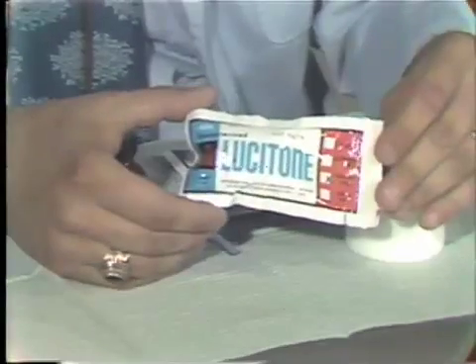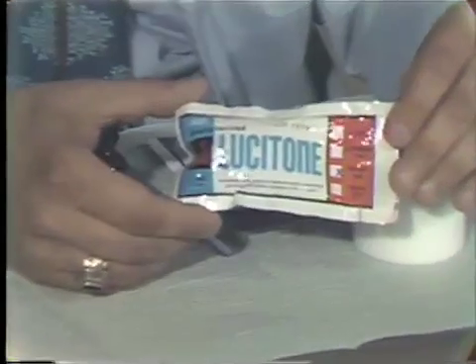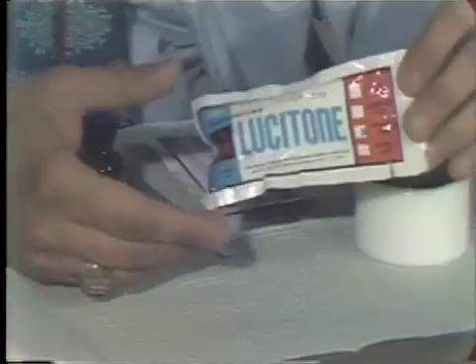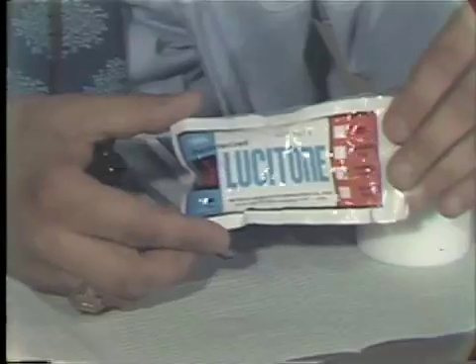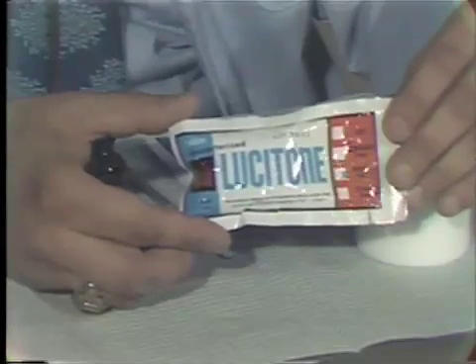We are now ready to proceed with packing our denture flask, now that we have boiled out the wax and the base plate. To begin with, we are going to mix our acrylic. We will be using Lucitone, which is a very good heat-cured material. I'm going to proceed to mix the material now and then let it set while we proceed with the other steps.